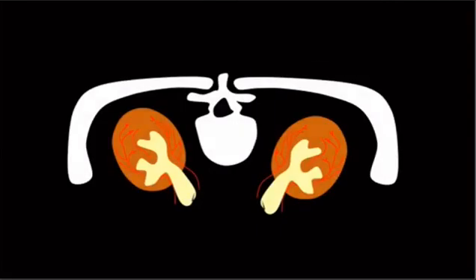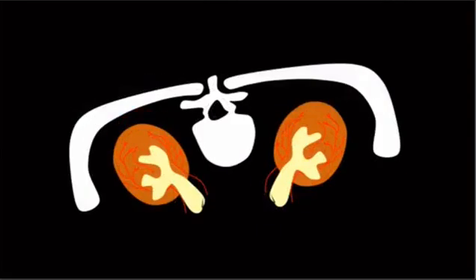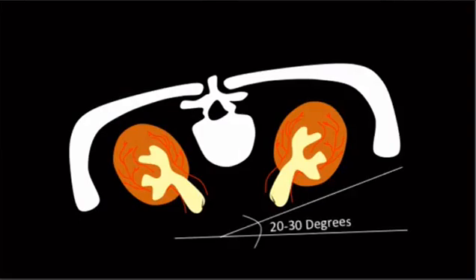All right, so what does a procedure look like? So typically, the patient is placed prone. Most places will angle the ipsilateral kidney like 20 to 30 degrees. Most places will tell you to target about 10 centimeters lateral to midline, but not beyond the posterior axillary line.